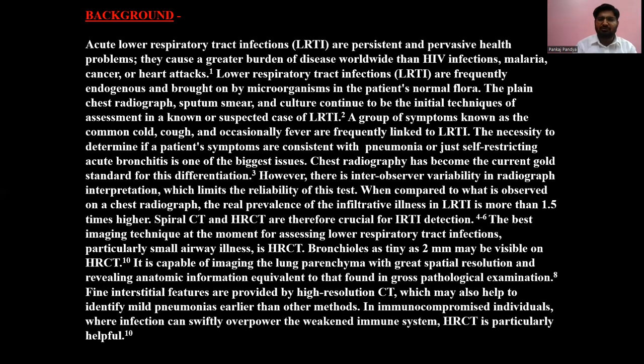However, there is inter-observer variability in radiograph interpretation, which limits the reliability of this test. When compared to what is observed on chest radiograph, the real prevalence of infiltrative illness in LRTI is more than 1.5 times higher. Spiral CT and HRCT are therefore crucial for LRTI detection. The best imaging technique at the moment for assessing lower respiratory tract infections, particularly small airway illnesses, is HRCT.